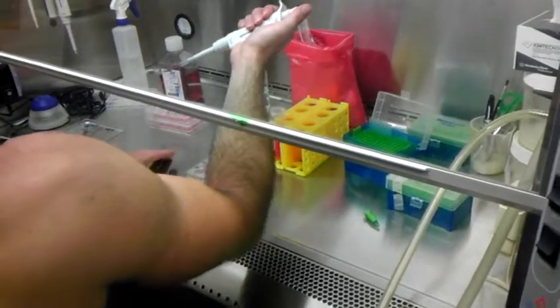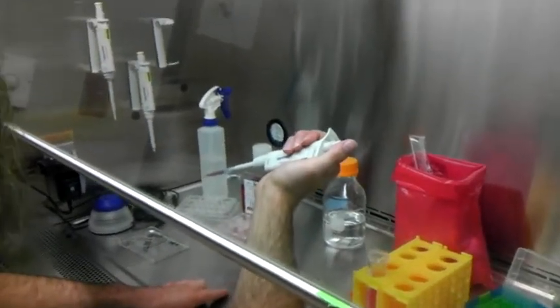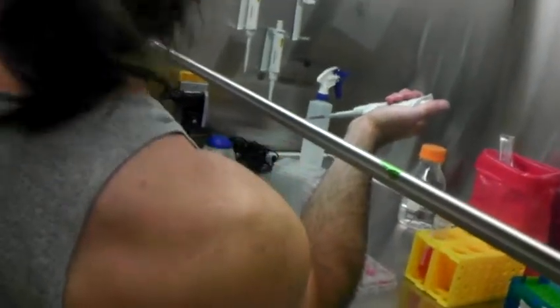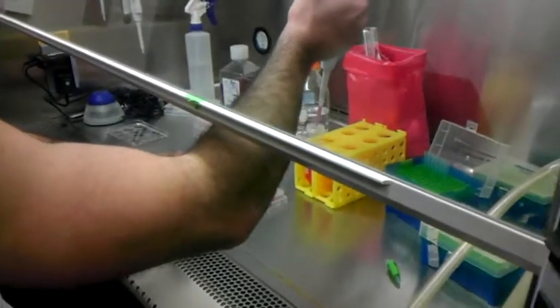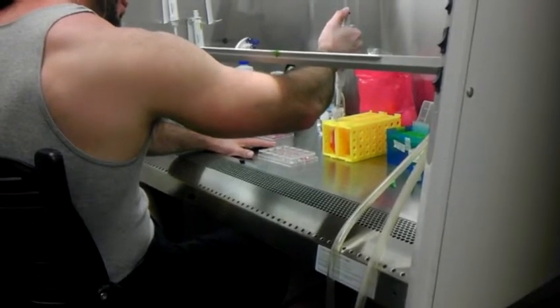Just for my curiosity, if I pull out something like this from a measurement, and the tip is missing, is that acceptable? It's not 800. It's close enough. That one is close enough, but if there's more than that, that's probably 50 microliters of fluid out of 800. If we were doing an actual experiment, we would want to make sure it's completely full. The reason 800 is important is because you want to cover the entire gel. If you do less than 800, you might not cover the top of the gel, and the cells might not be covered in fluid. That's the real issue.